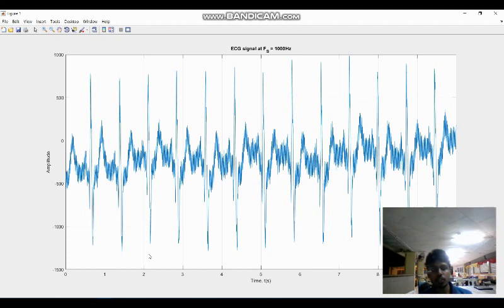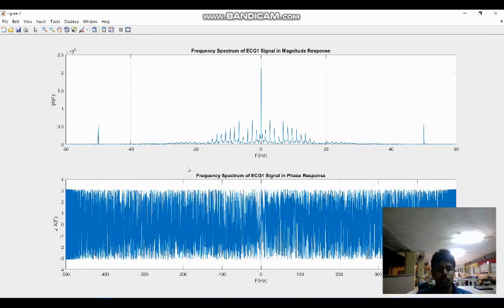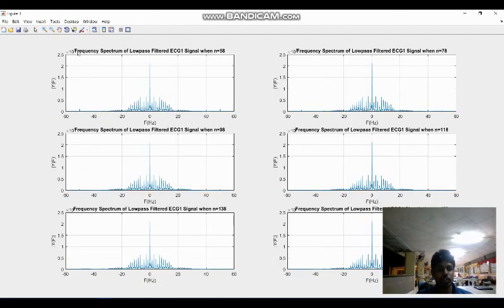As for my part, I am going to explain the outcome of the whole coding. Figure 1 shows the ECG signal 1, which is sampled at 1000 Hz. As we can see, the signal is distorted due to the 50 Hz power line interference. Figure 2 shows the frequency response of ECG signal 1. From the magnitude response, we can see this extra signal component at 50 Hz, which is caused by the power line interference. Figure 3 shows 6 different frequency spectrums of the low pass filtered ECG signal 1 at different orders, which are 58, 78, 98, 118, 138 and 158.